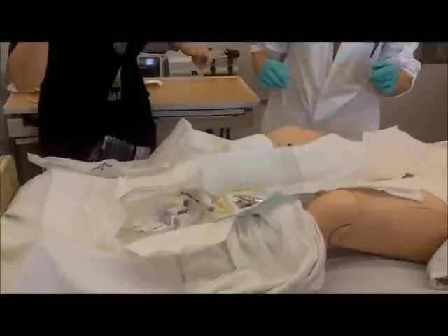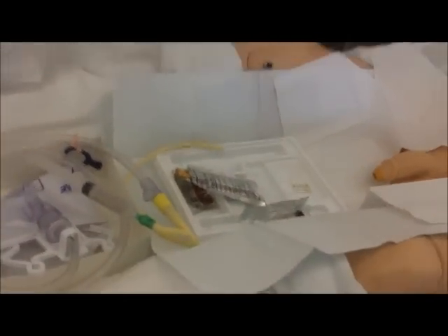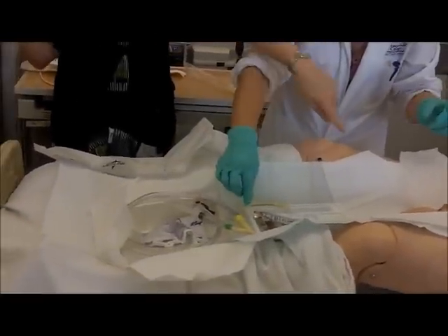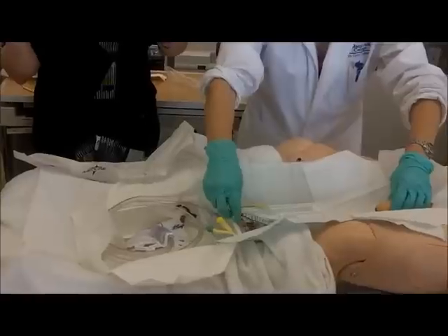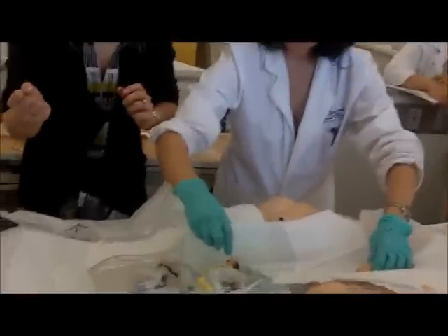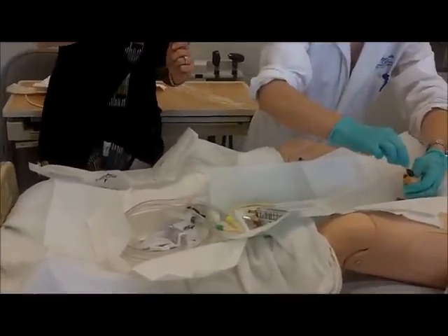Next what you need to do is always think: clean hand, dirty hand, clean hand, dirty hand. Now you need to clean with your dirty hand — this is your dirty hand. Grab his penis. And I'm cleaning this way. You're going to take it, it's like 90 degrees up. Circle in, like this. And then to the outer, from here.